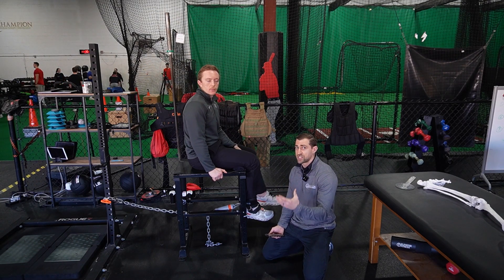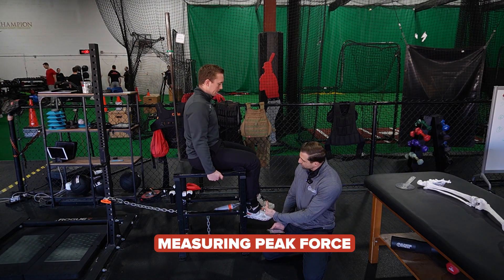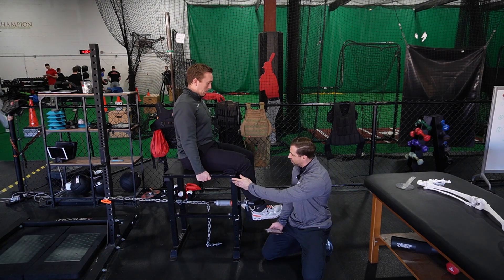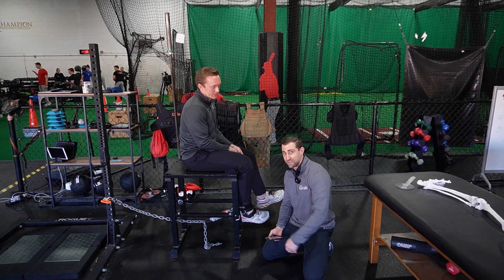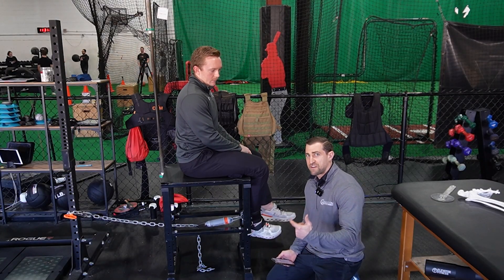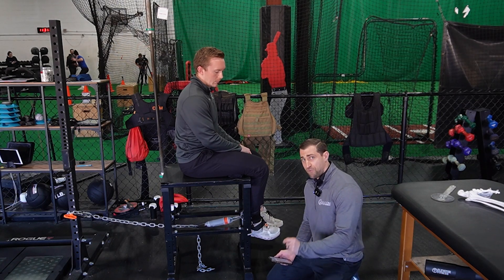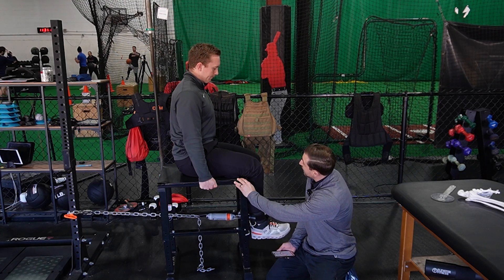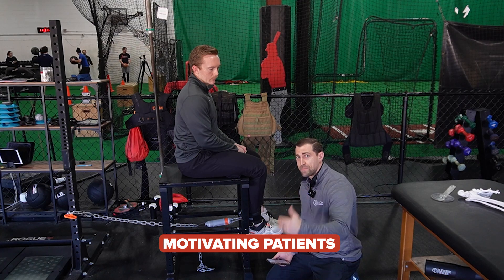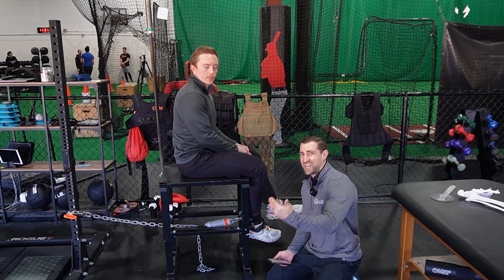My cueing changes based on what I'm trying to measure. If I'm trying to measure peak force, I have the athlete push very slowly into the pressure until they meet the resistance, then ramp up and push as hard as they can. I want to motivate them — if I yell a little bit, it's probably going to increase their strength. It's important to be consistent from patient to patient, but also from test to test. If at month three I tell him to push as hard as he possibly can, but at month four I'm quiet and say 'go ahead and push a little bit,' he might appear weaker on month four simply because I didn't motivate him enough.